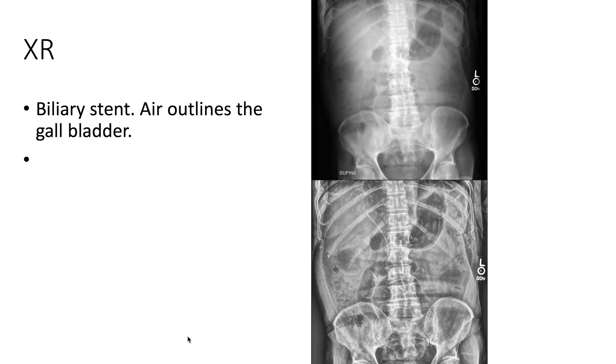On x-ray, we see the biliary stent. We also see that there is air outlining the gallbladder.